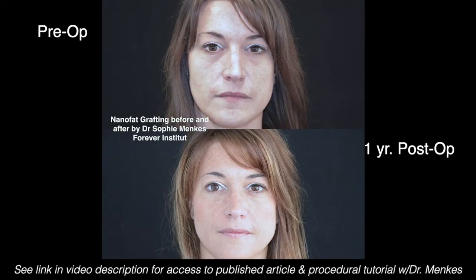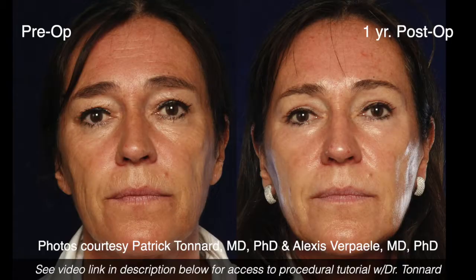Our doctors have had some amazing results. Here is a before and after photo from Dr. Sophie Menges, Geneva, Switzerland, using Tulip True NanoFat by itself to achieve non-surgical facial rejuvenation and skin tightening. Next, we see a before and after photo from Drs. Patrick Tenard and Alexis Verpail from Ghent, Belgium, showing a combination of MicroFat and Tulip True NanoFat. The results are just as amazing, using both in combination to fill and give structure to the face and rejuvenate the skin using Tulip True NanoFat.